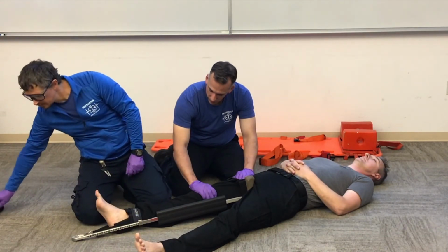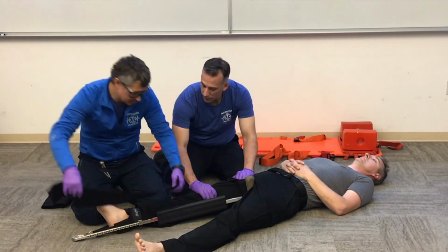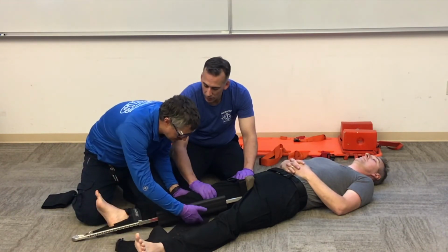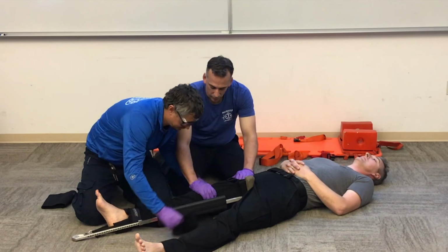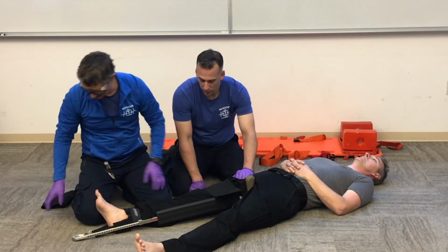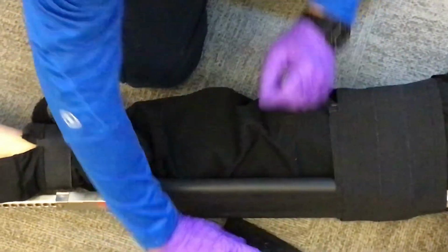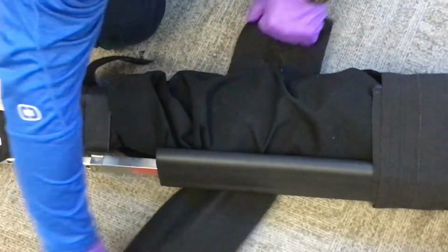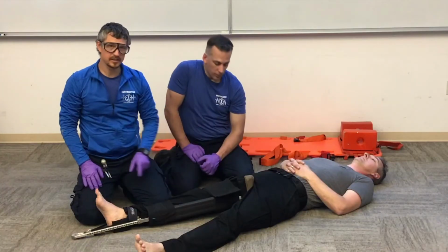Once we have our device in place and traction pulled, we're going to secure our device. We can use the space underneath the knee to slide our securing strap. Going to secure that to the thigh. Now Nathan can stop holding stabilization. And using the knee, we're going to slide that under and floss it down to the calf and secure the device to the leg.